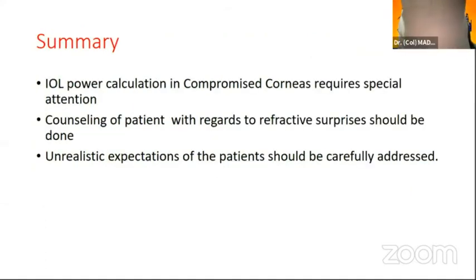So in summary, you do require a topography. If access to an optical biometer is available, that would be ideal. And most important is counseling your patient to not have unrealistic expectations so that you are saved the trouble at the end of the surgery.